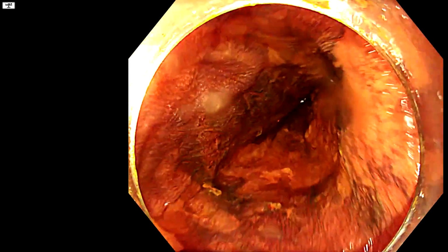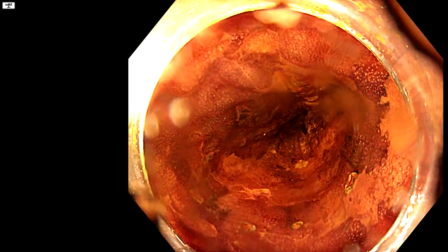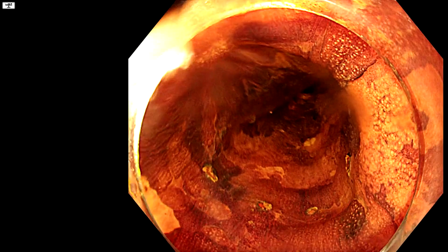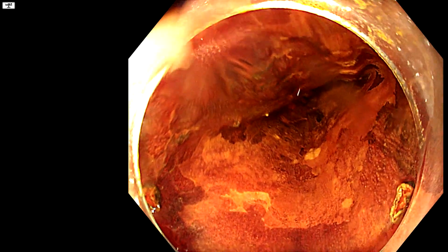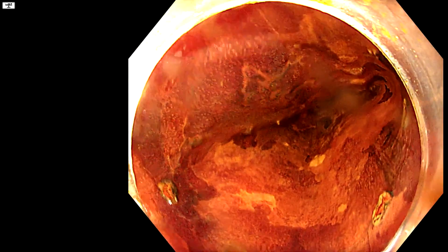So you have to be careful with this because, of course, cancer can look the same as not very well stained, I would say. But you can see that for sure the main area of abnormality, if we just freeze it, is located within the dots.